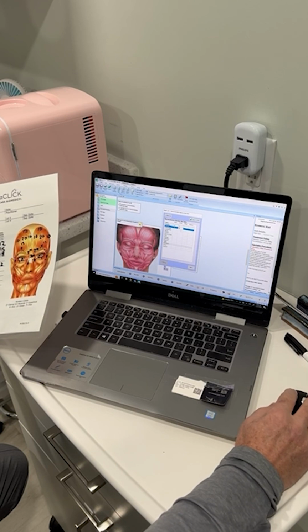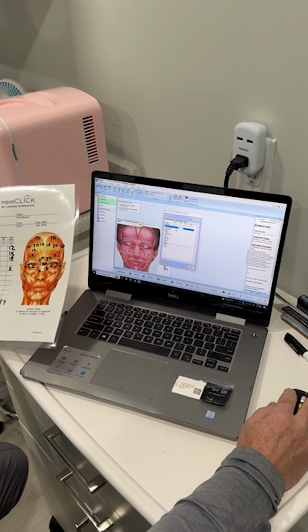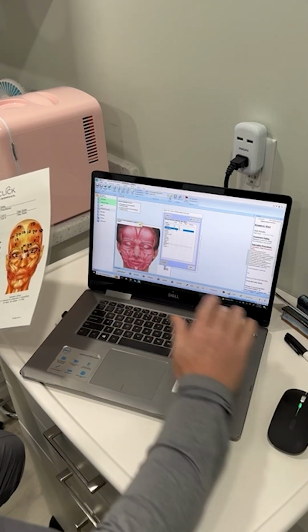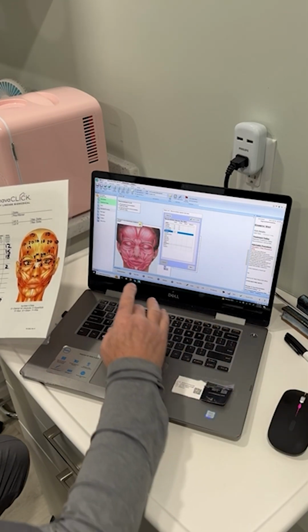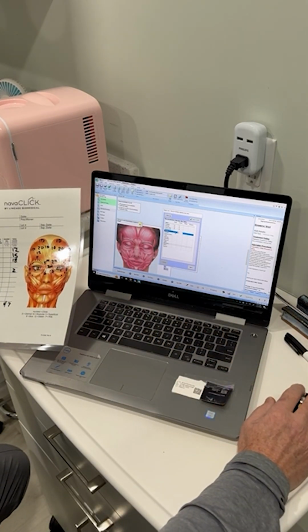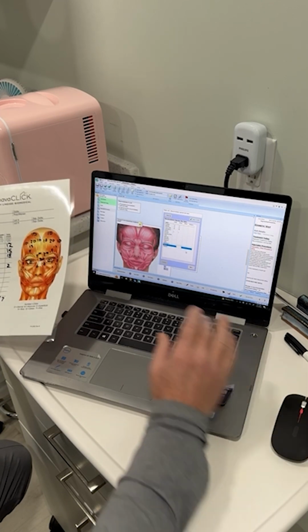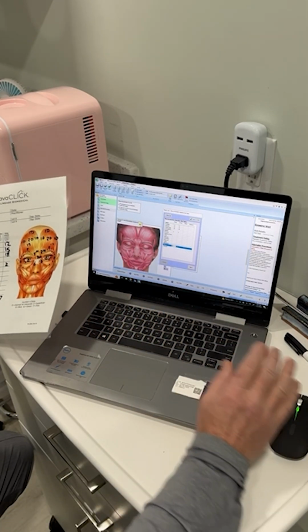And if you're doing Dysport, you would do your clicks and then backtrack it to 3. So crow's feet, we did 18. And nasalis, we did 2 units. And that's our total of 47 clicks and 47 units.